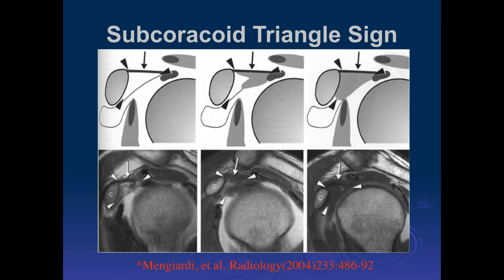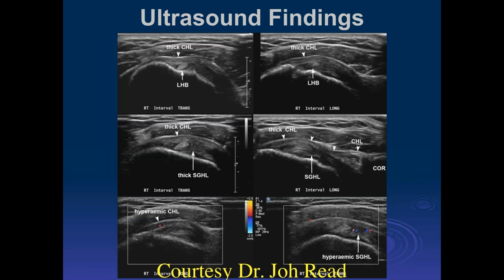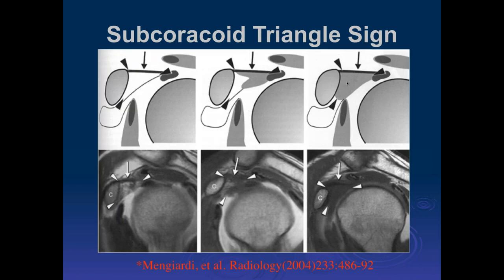Here's much more so. And it's complete socked-in loss of the fat within the rotator cuff interval. You can see these with ultrasound findings. And one of the things you often look for is the biceps tendon, because the biceps tendon is intimately involved here. And many people believe that a lot of the symptoms of pain with adhesive capsulitis is actually involvement of the scar tissue adhering to the biceps. Then whenever you flex and move the biceps, it irritates it, producing shoulder pain.